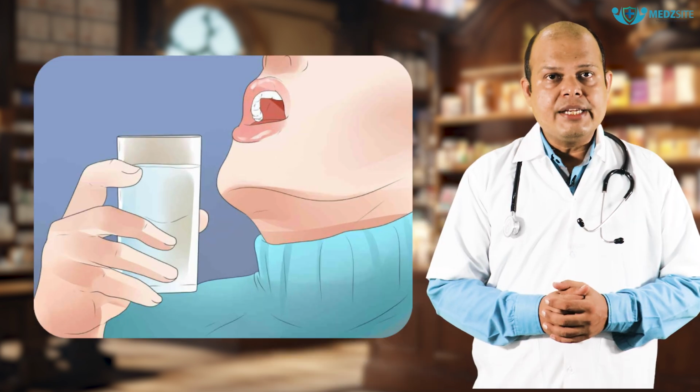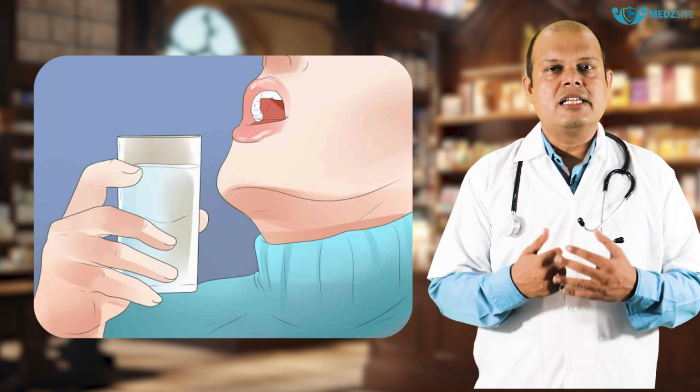After inhalation, cleaning the inhaler is also extremely important. You can clean it with a dry tissue and close the device after use. After all puffs are taken, rinse your mouth with water and spit it out.